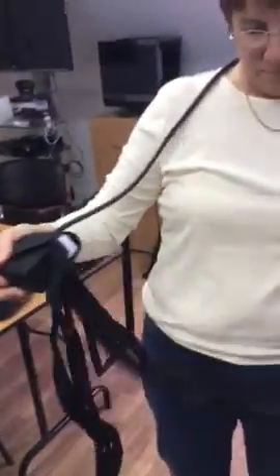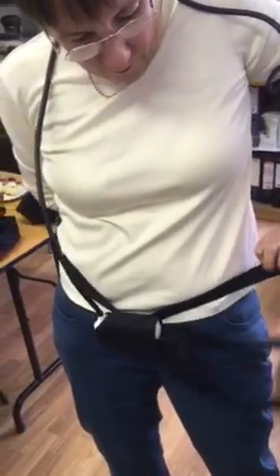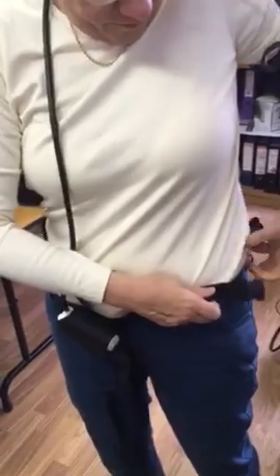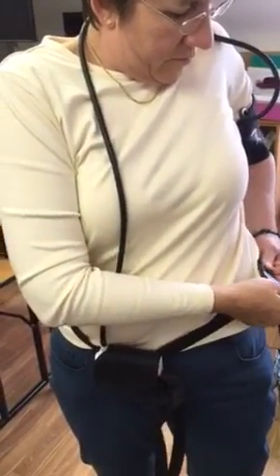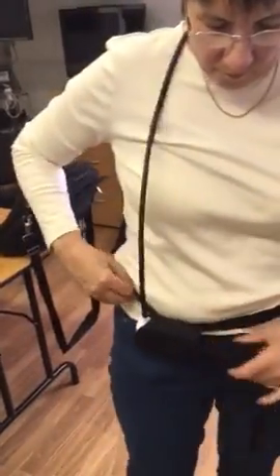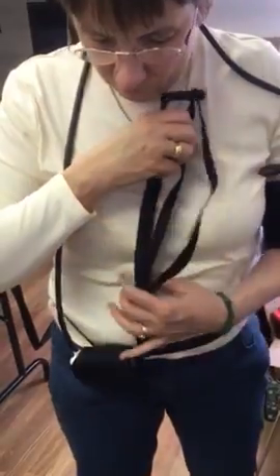And the belt has two forms. One goes around the waist, and some people are happy enough to just have it around the waist. But you should also notice that there is another strap that can go around the neck. Whether you use this or not is between you and the patient. But you will need to use the belt strap. A patient is ready then to take this home. You can lengthen the one around the neck if you wish.